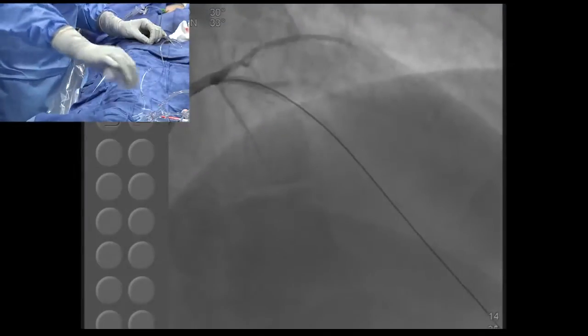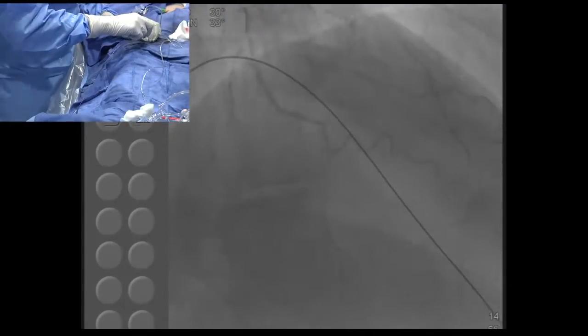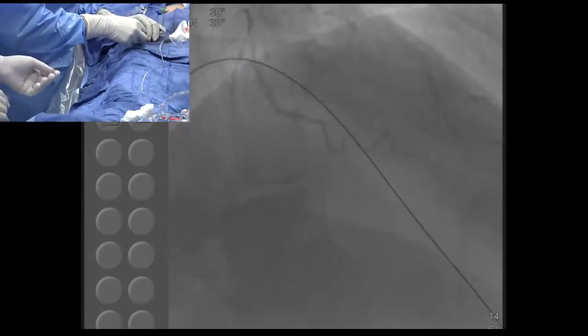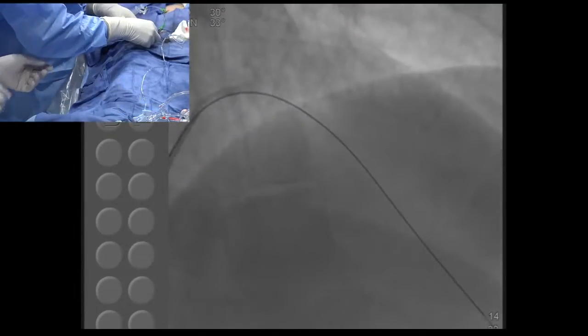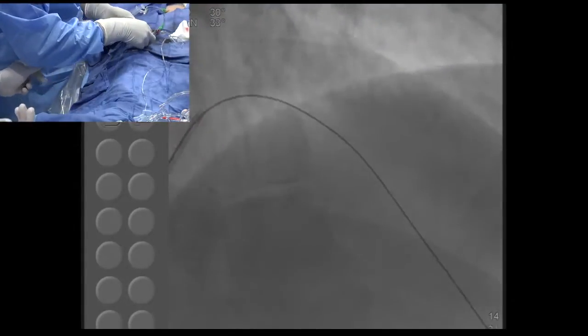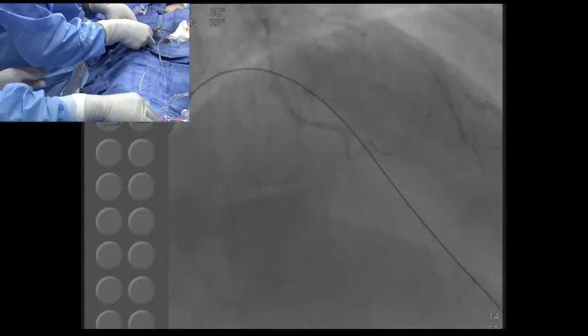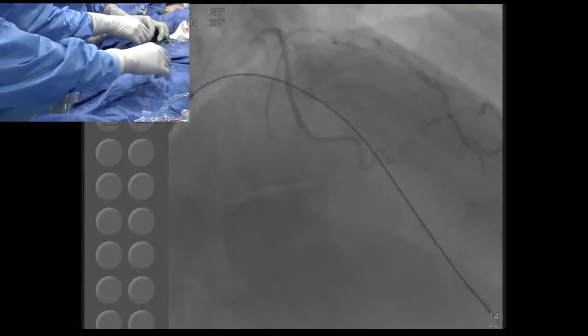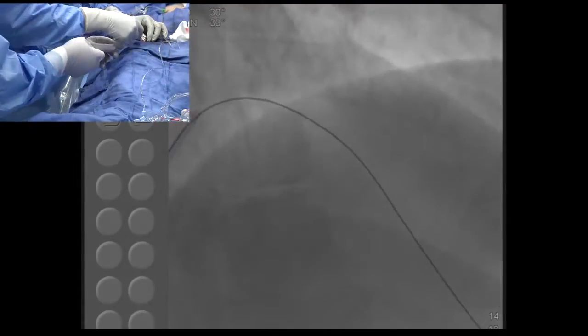Sameen, before sizing the stent, a little nitro here, or do you feel... No. I think absolutely. What did you want? The nitroglycerin, we take a picture. But I would say it's the same. Once you get to a 3.0, whether it's a 3 or 3.5, it's the same stent. You just have to change the.